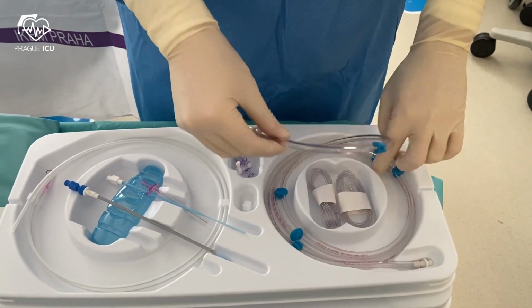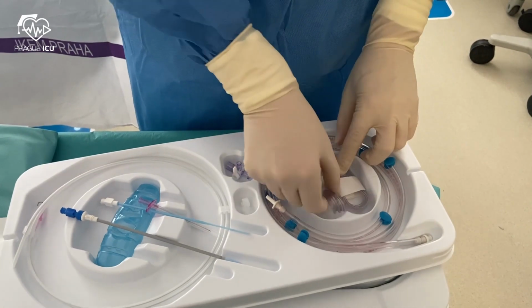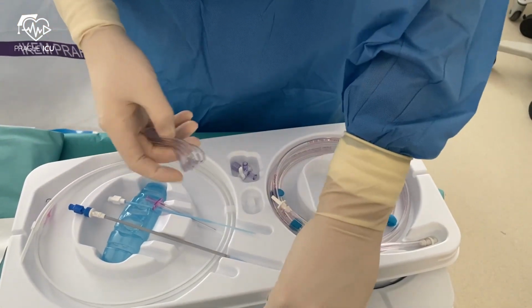Then helium connecting tubing and another pressure connecting tubing with a 3-way stopcock.